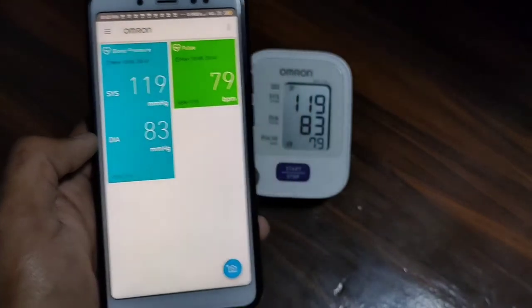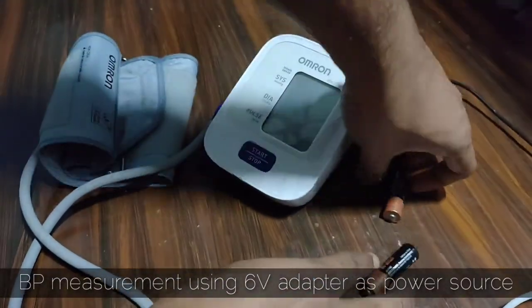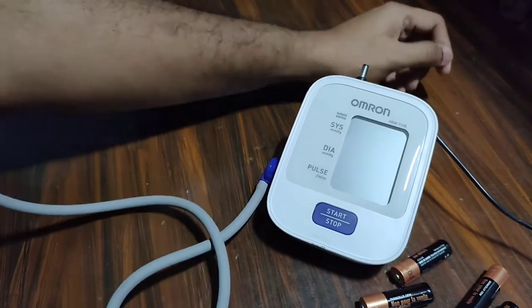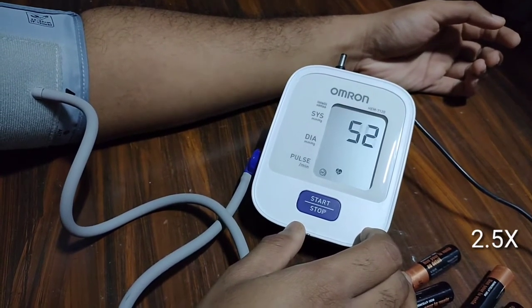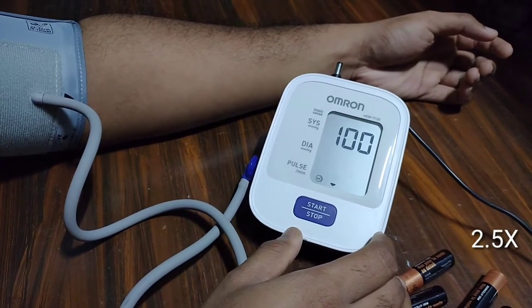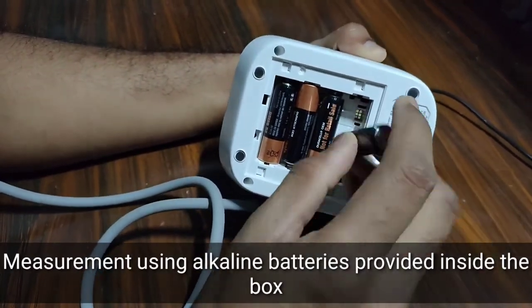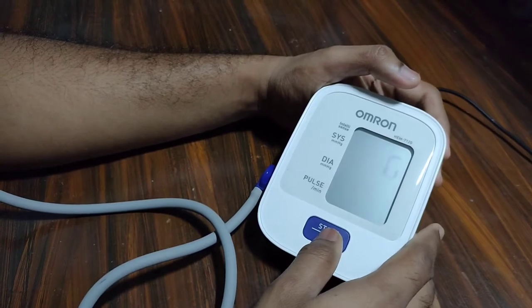The device doesn't require Bluetooth connectivity for the app. In case you run out of batteries, this BP monitor can also be powered using a good quality 6-volt adapter. Omron claims a battery life of 1000 measurements for every new set of batteries.